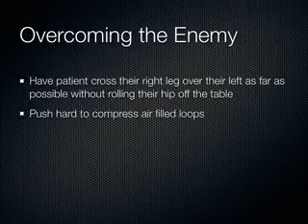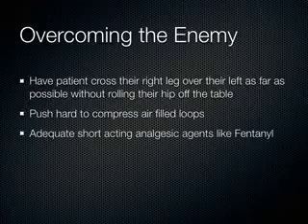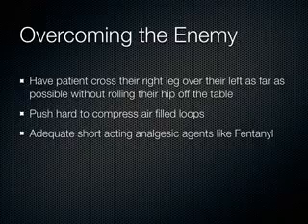And then you're going to push really hard. You're going to push harder in the abdomen than you've ever pushed before with an ultrasound transducer today. But don't worry, the models are getting paid to tolerate that. They'll push you away if it hurts too much. We also are going to give the models fentanyl. We're going to give them narcotics today. Just kidding. No, but in reality, this is what you do, okay?